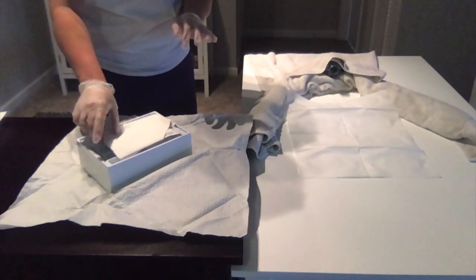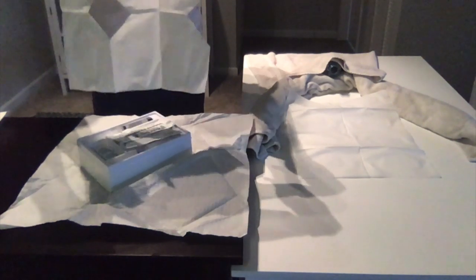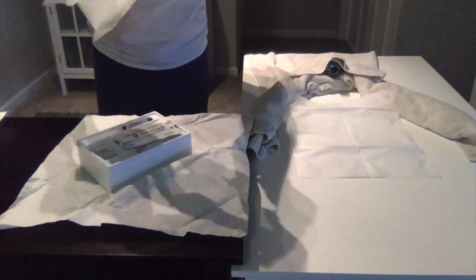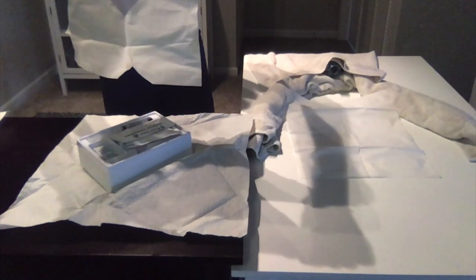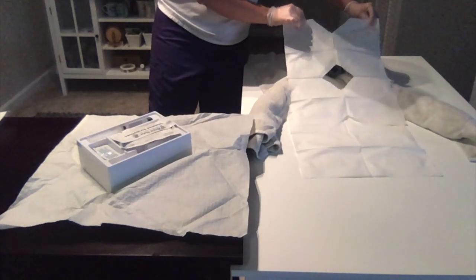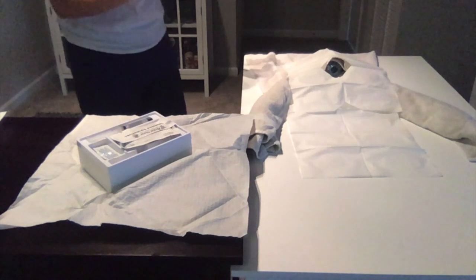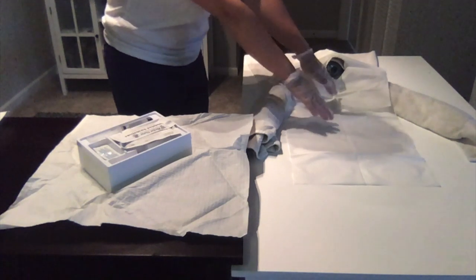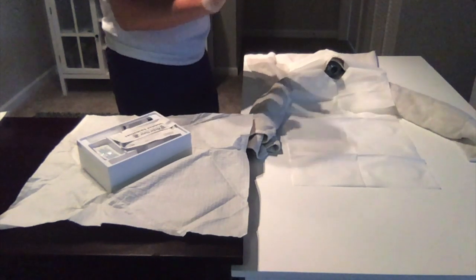So once I do that, I'm going to grab my drape, my diamond drape, and I'm going to just open it up. And I'm going to look for the shiny side. And I'm going to go not over it, but I'm going to go this way. This is sterile. And then put it over. But my body is not over the field whatsoever. So once I do that, I can get situated by keeping my body far away, and I'm using the hands. But this is all sterile, so that should be okay.